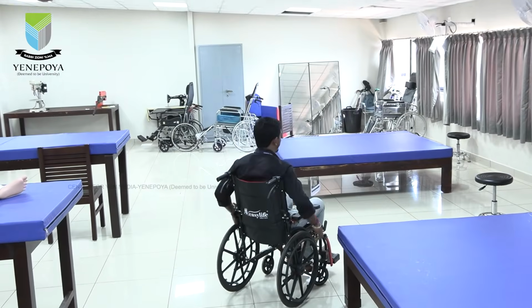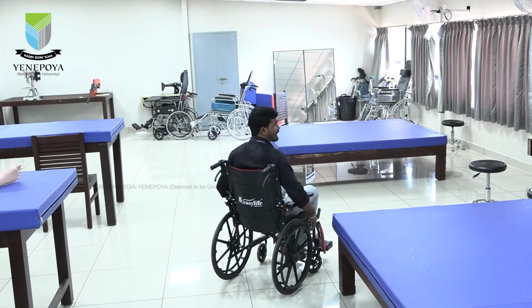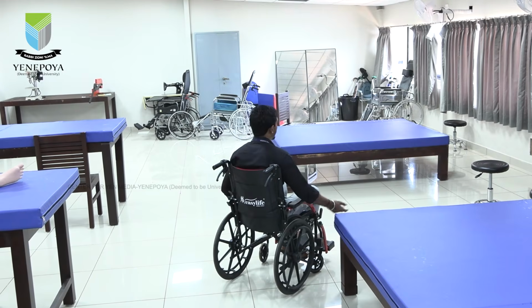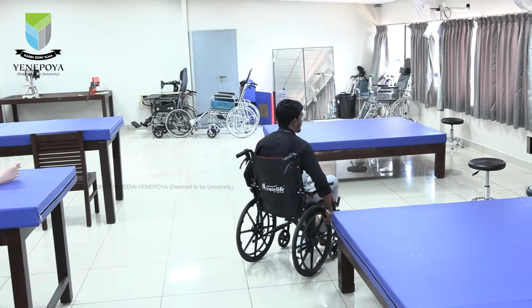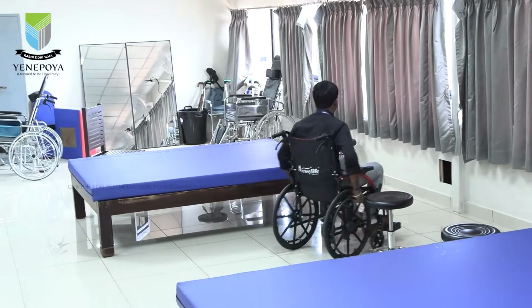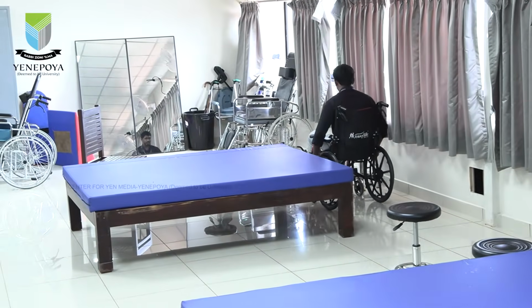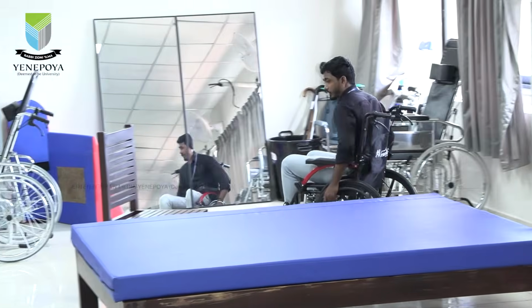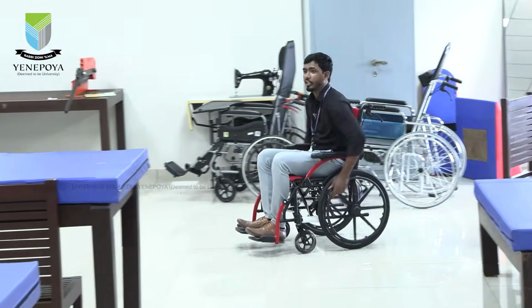Next we are going to see how the person has to do the obstacle coursing. As an occupational therapist, I will train the person to be very much independent, outside in the community and also at home. So I will give a task which has more clutter, so that the person has to perform and adjust themselves like this. Because all the objects in their home will be in the same area only, they should not touch any of the objects, yet the person has to move from this side to that side. So like this also we have to go.